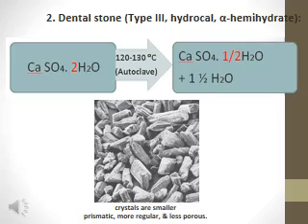We heat the crushed gypsum in autoclave at the same temperature. Okay, but it is a kind of special treatment. So the obtained powder particles will be more prismatic, I mean more regular, smaller, and less porous than plaster of Paris powder particles.